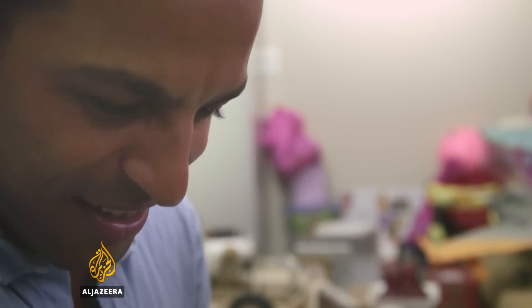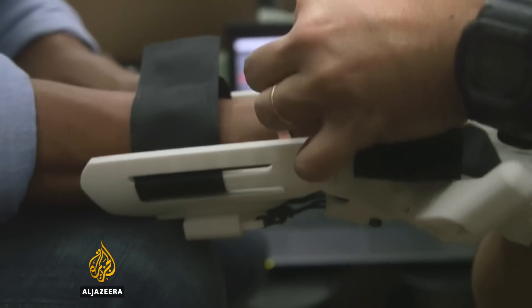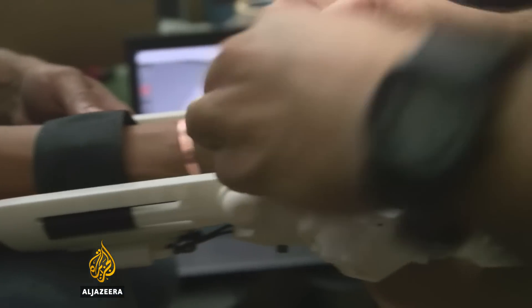The hand works for children who are missing fingers or arms below the elbow and fits onto the remaining arm. It has no electrical parts. Instead, it uses an elastic tensioning system which allows the hand to flex and grip.